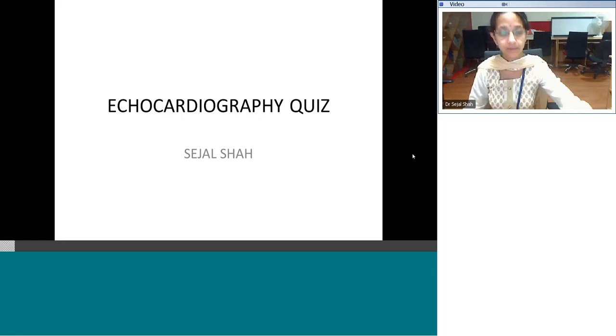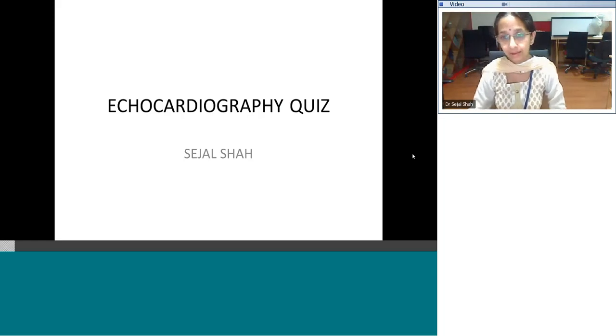Today we have an echocardiography quiz. I think, when I made this quiz, I understood that there are going to be fellows from all the levels and all the years. So it might be a little more challenging for some of you, but I think it's going to be a good process for all of you to give it a thought on the images. And then we will also have a short discussion after the question.